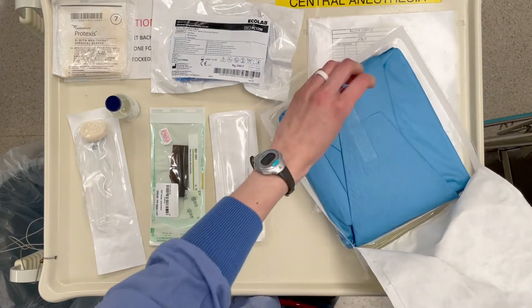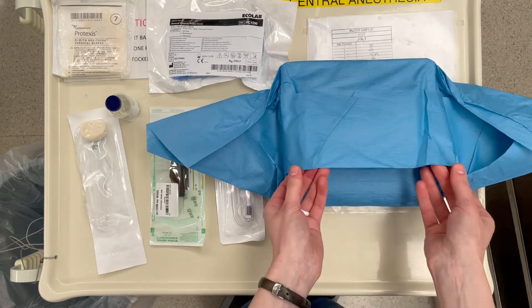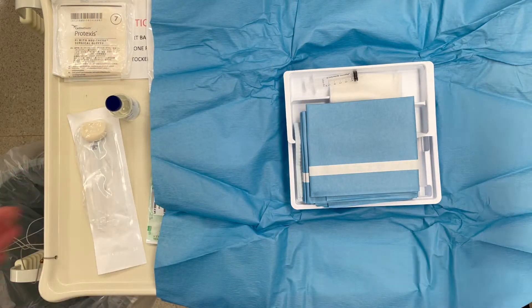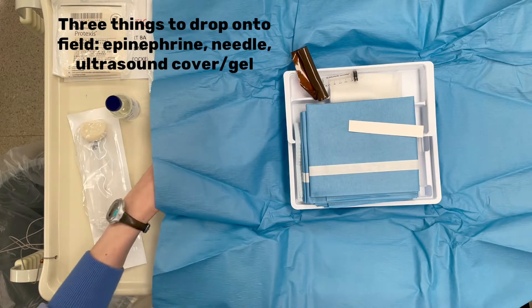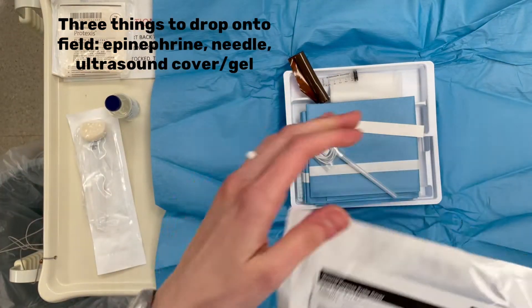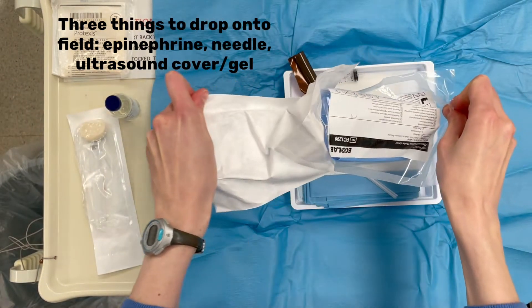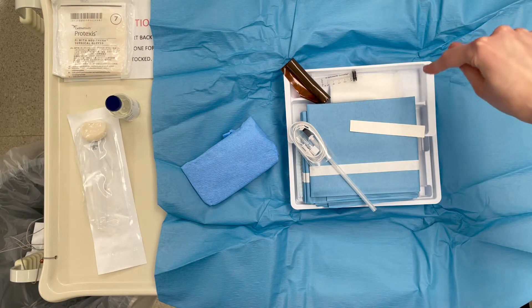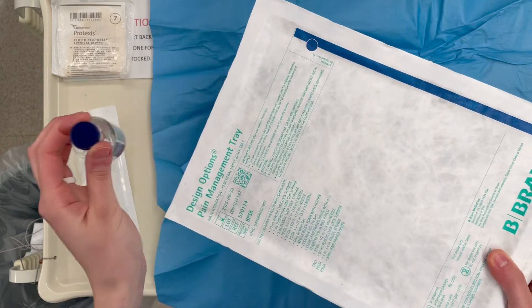We're going to open this up. First step is just getting stuff open and dropping your sterile items onto your tray. So we've got our epinephrine, your needle, and the thing that is the most difficult because it's huge and clunky — your ultrasound probe cover. All this stuff is kind of piled up together, and that well right there is where we need to put our local anesthetic.